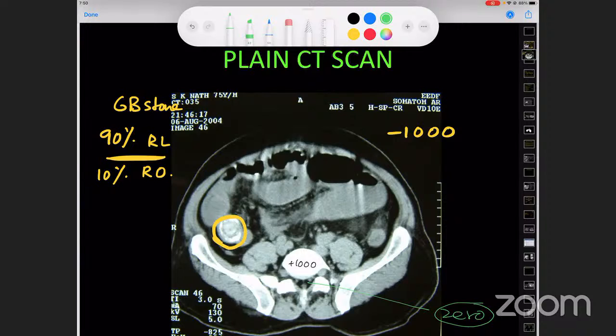it starts from 85 to around 300 to 400. Bone is 400 to 600 plus Hounsfield units, and metal is plus 3000 Hounsfield units. So it is a huge range. The spectrum is huge. So on X-ray, we could say only whether radio opacity is present or not, and the sensitivity is much lesser.